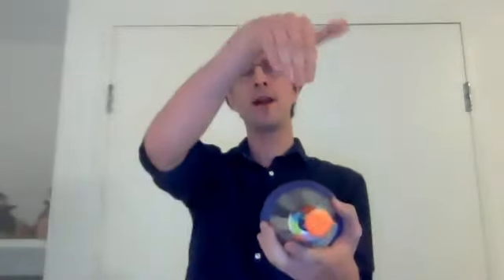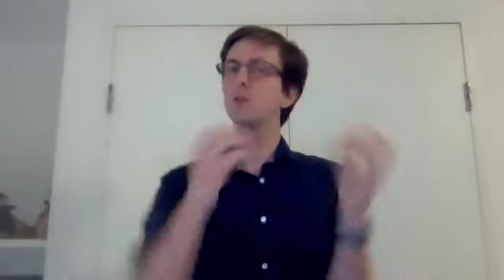So to demonstrate this, I will need a volunteer, which here is our lovely volunteer. So she will play the part of the patient. The patient remains still, and we have our radiation source that rotates around the patient. It might radiate from this angle, and from this angle, and from this angle, and the angles are calculated so that where they intersect is the tumor. This makes sure that we are concentrating the radiation in the tumor, leaving minimal radiation in the healthy tissue.